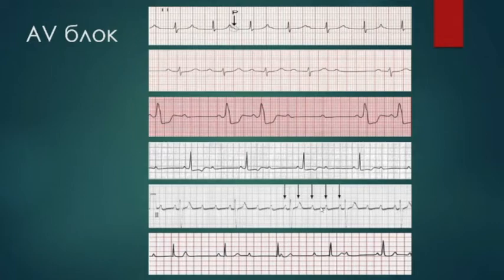So, what are the possibilities there, as we have talked about the SA node disturbances? One of you, I heard a female voice saying AV block first degree, right? So what is the definition of AV block first degree? It's where it's above the normal threshold, but you still have a QRS for every P, right? Yes, and what is the upper limit for the normal threshold? 0.2 seconds, I think. Right. So 0.2 seconds or 200 milliseconds, or one big square. Okay?